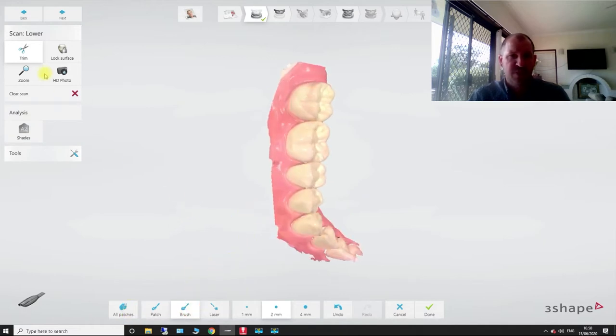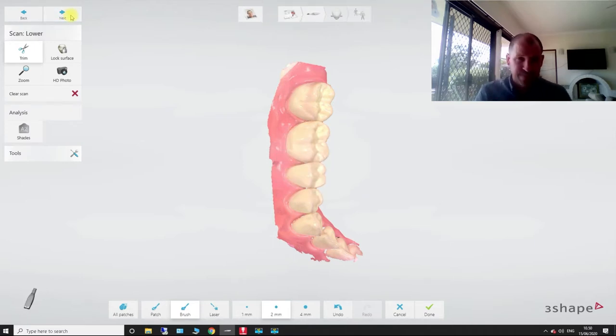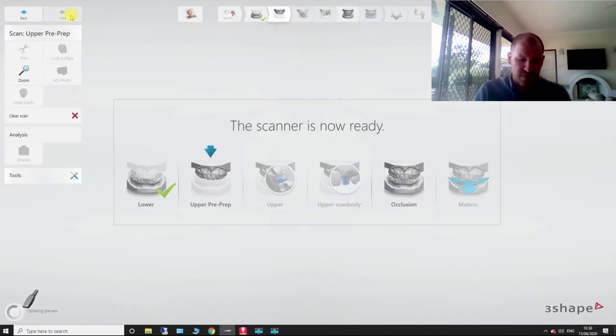And a quick trim over this side. Alright, let's change it back to brush rather than laser. And we're going to go next. So now, this next part of our scan is our upper.